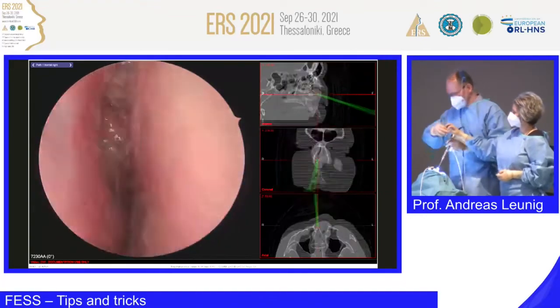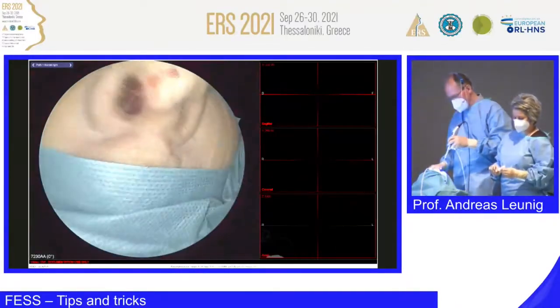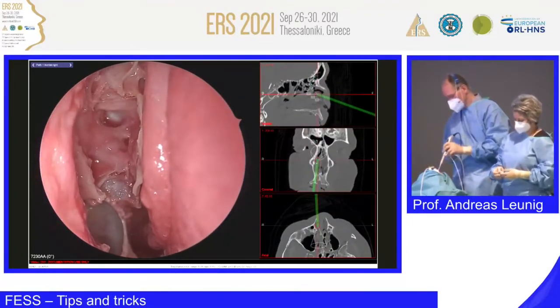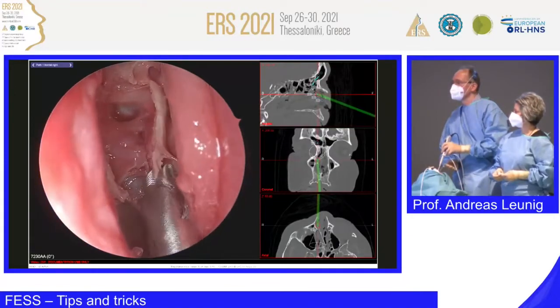Okay, I clean the endoscope again. And you see I'm cutting through these anatomical structures. So I'm going here. Check.